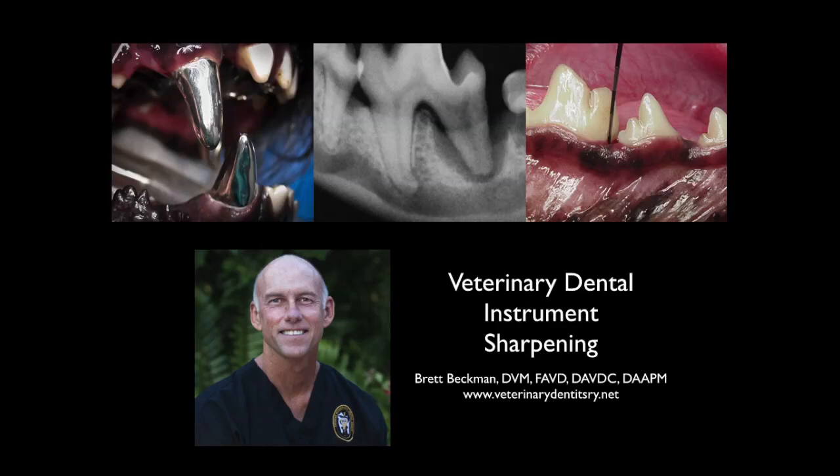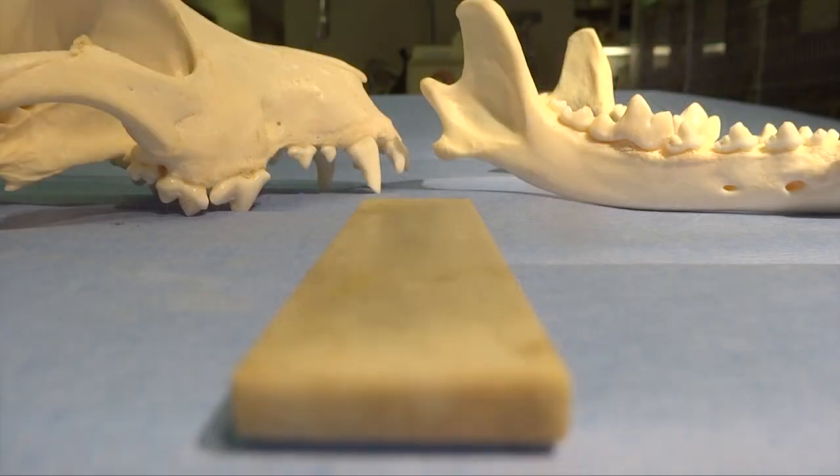I'm Brett Beckman. I'm a veterinary dentist, and I'm going to demonstrate dental instrument sharpening on a periodontal curette, a luxator, and a periosteal elevator.